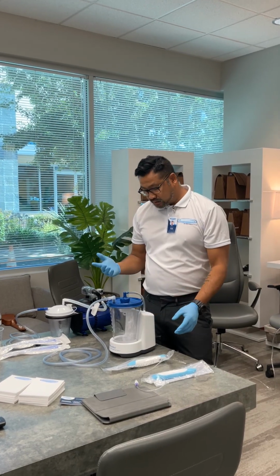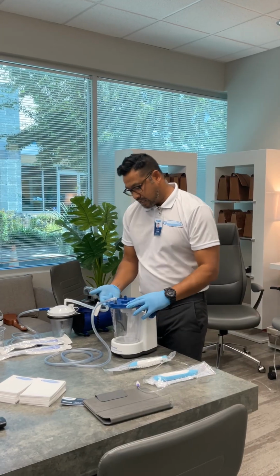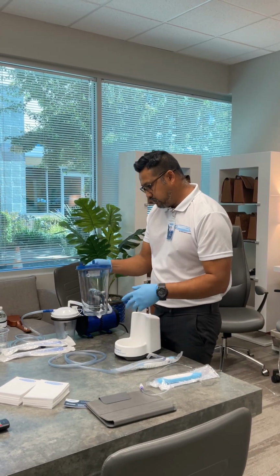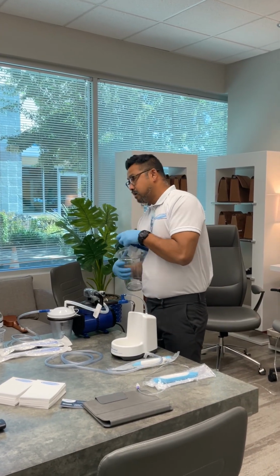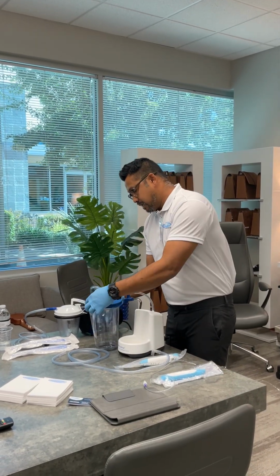Once you need to dump it, there's a little tab on the side. Usually caregivers can just pop it off, pour it into the toilet and flush it. Then you can rinse it out if you'd like to.